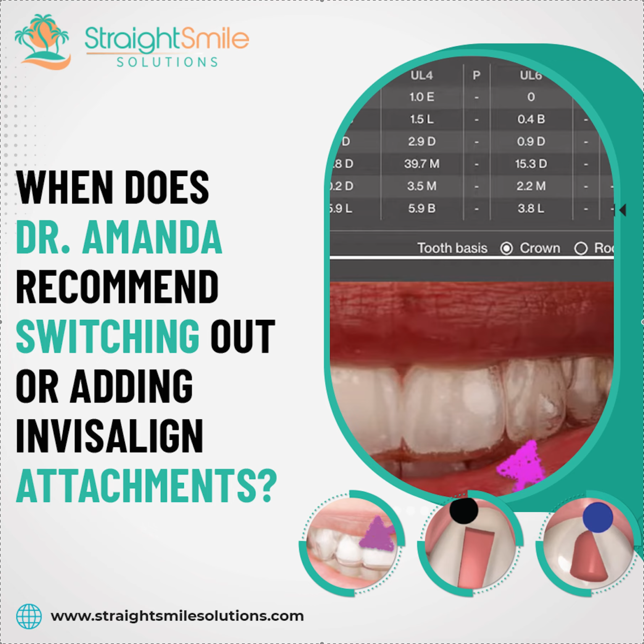So anyways, just to recap, I'm actually pretty bullish about Invisalign attachments. One of the reasons that I use this system and a couple other systems, and I don't use other systems, is that as long as I have picked the case properly, staged the case properly, and timed the case properly, and if you don't know what any of this is, you need to watch all the videos in my Invisalign channel, which are free, and as long as I've set up a virtual accountability loop, my cases go predictably, and I generally don't fool around with the attachments. Whatever the AI or the software says I need, it works.